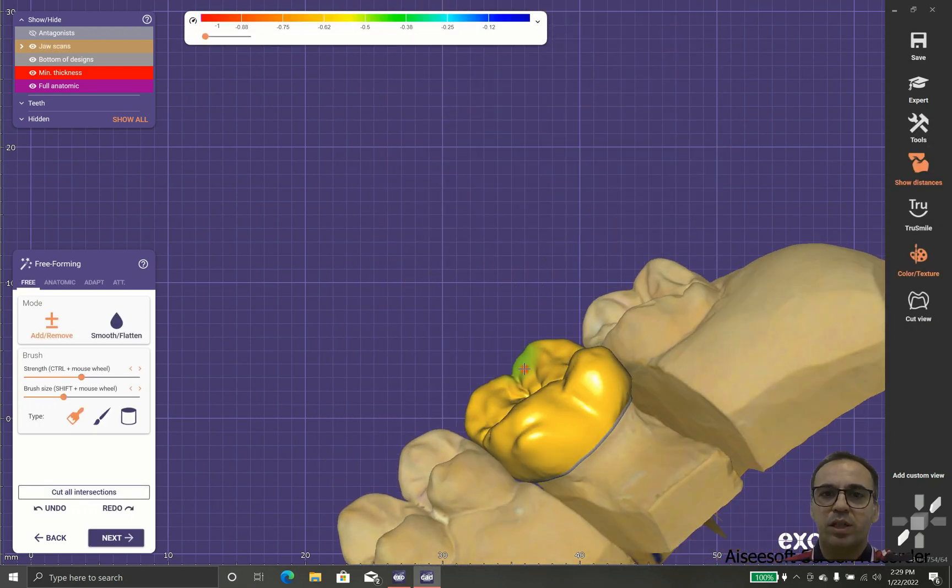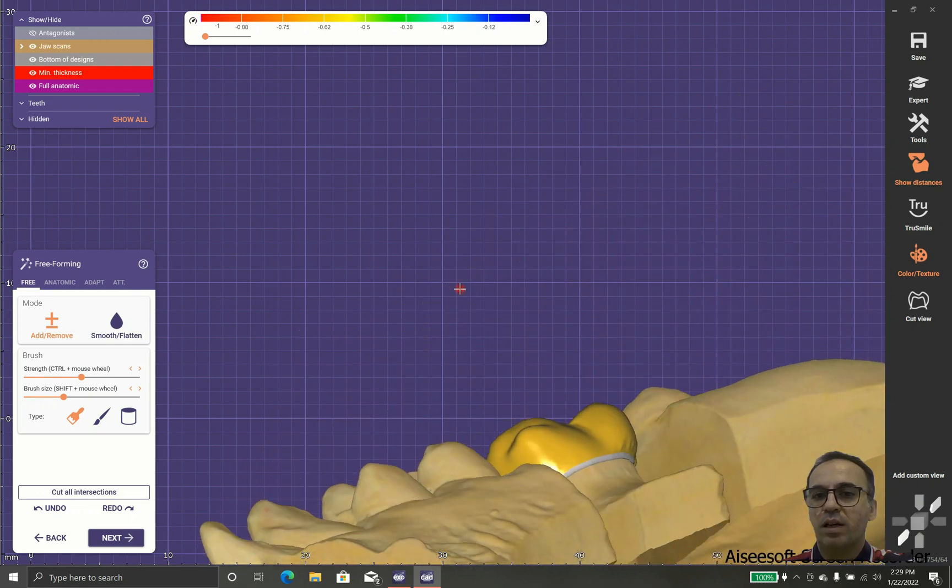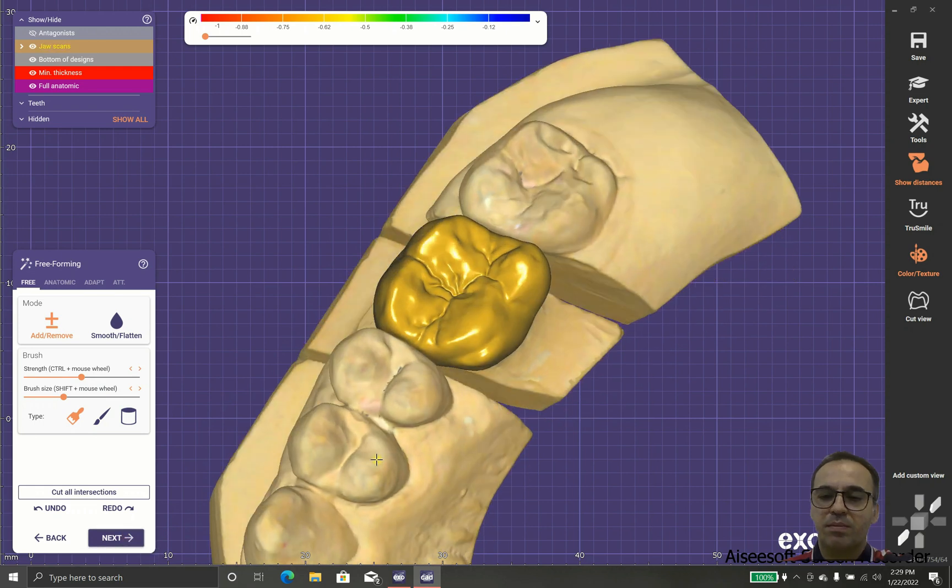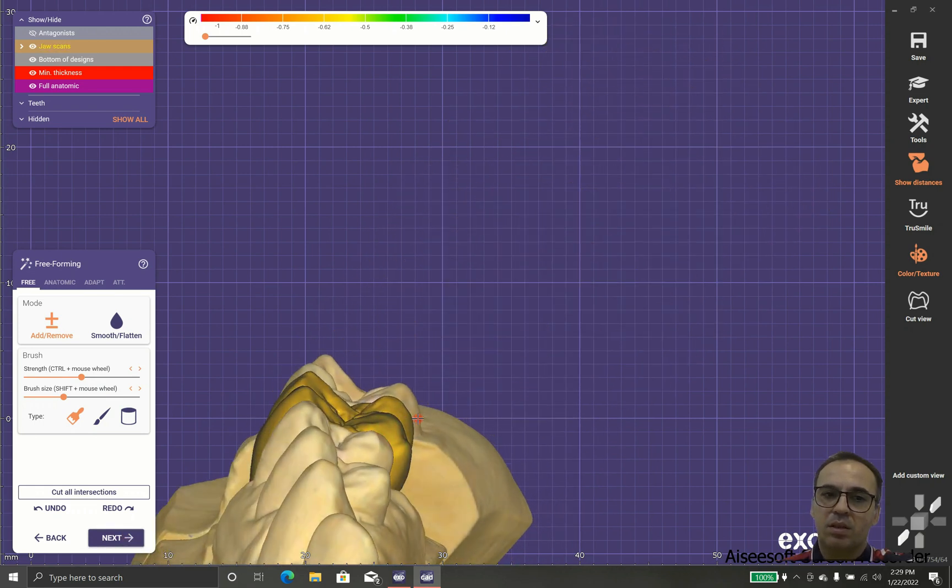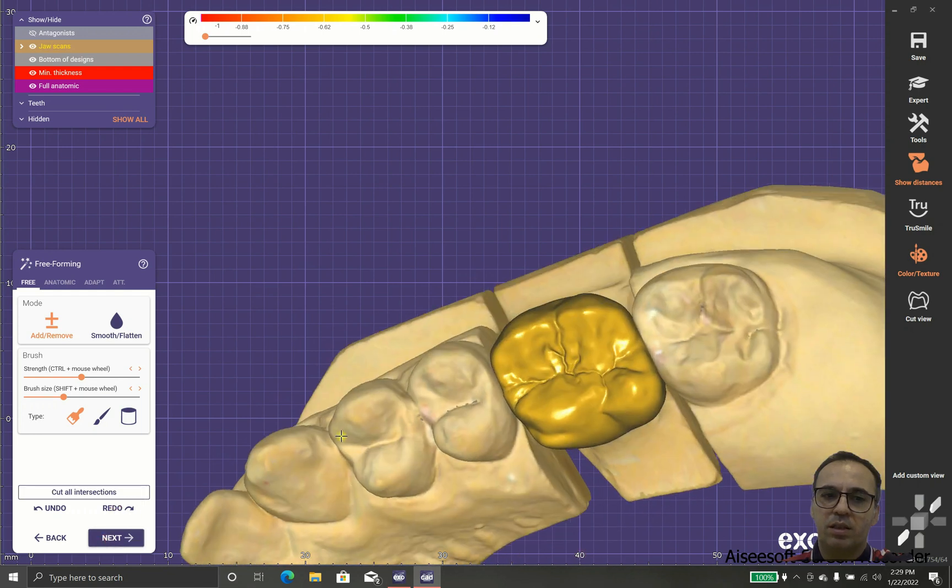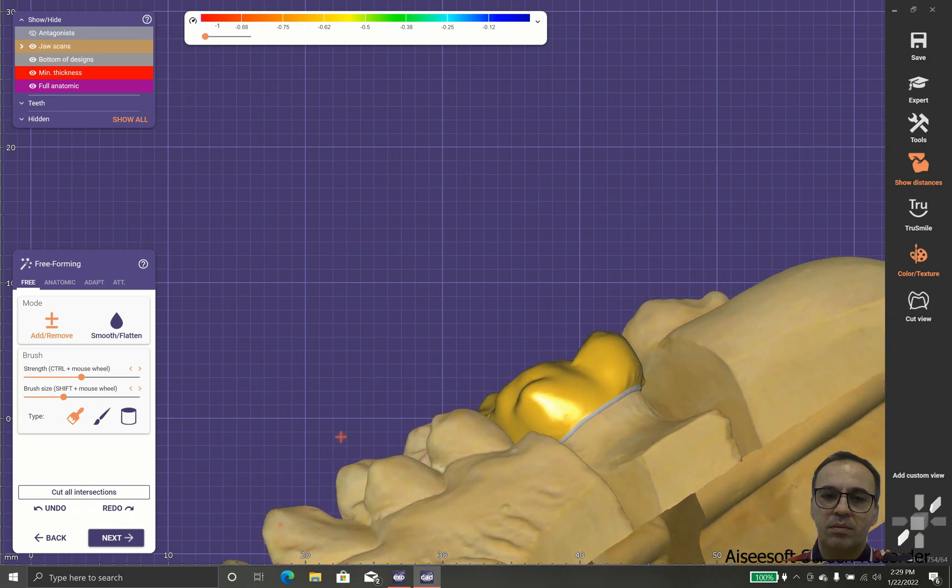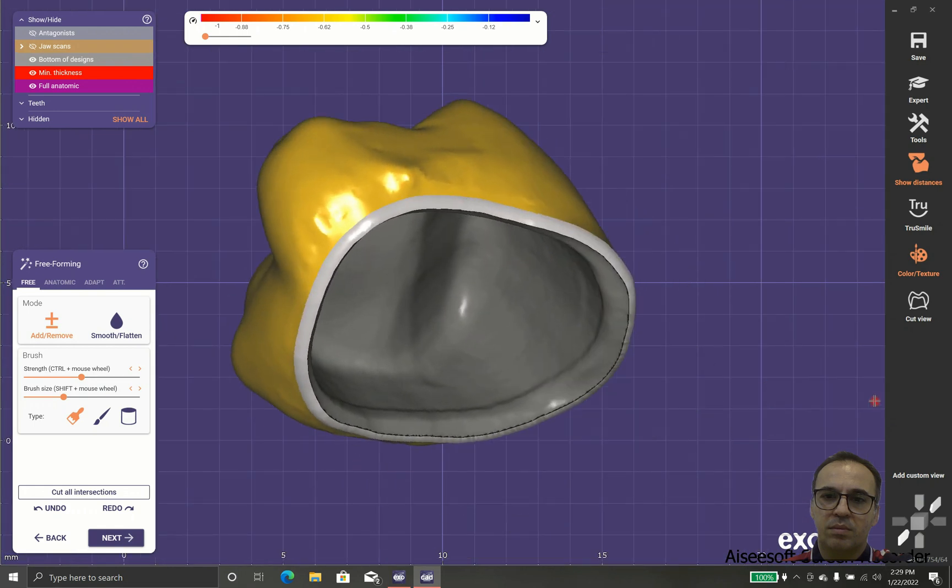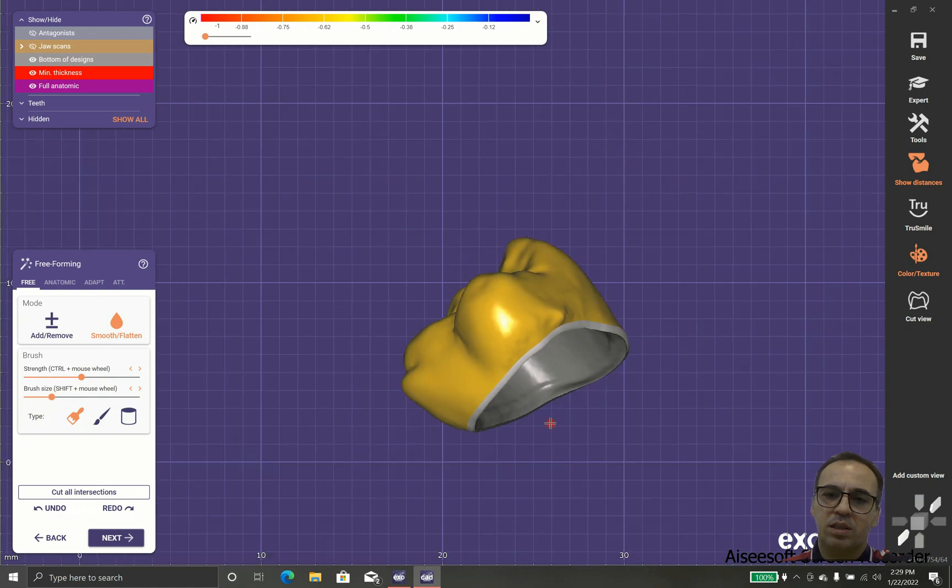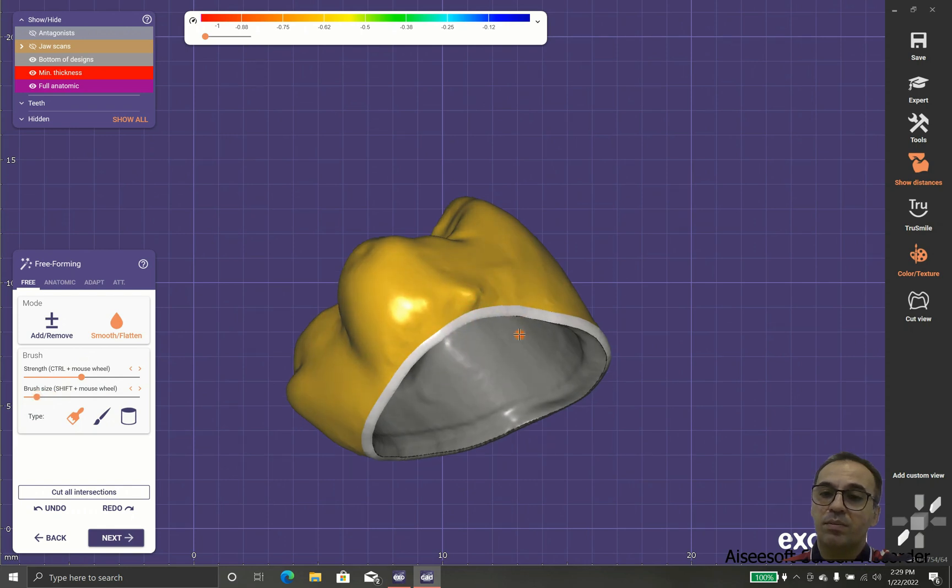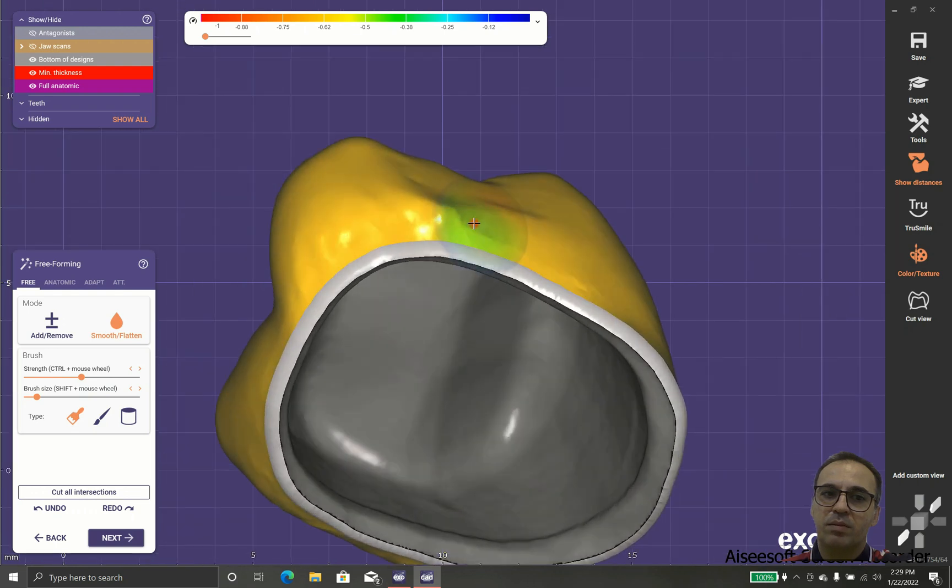I will check it from every angle, and as you can see we have lots of intrusion to our neighboring teeth. So what should we do? Let's check it again.